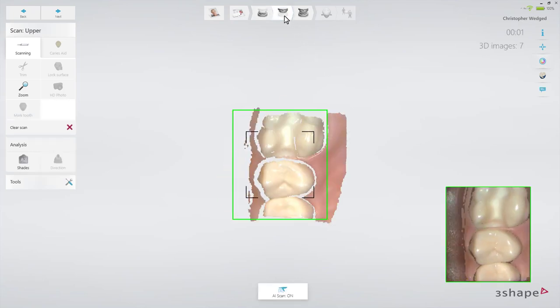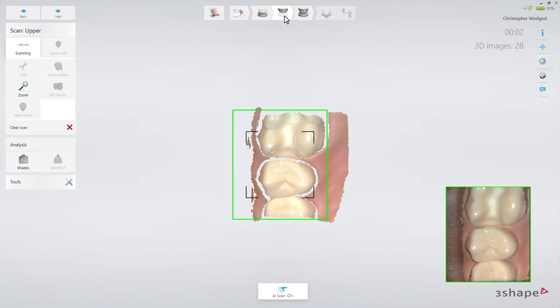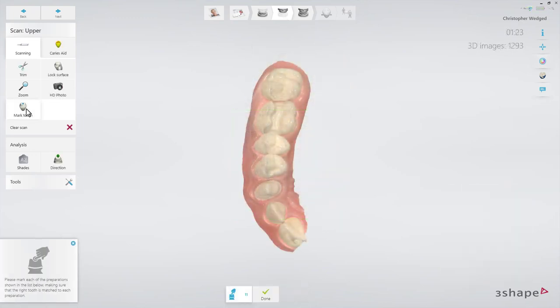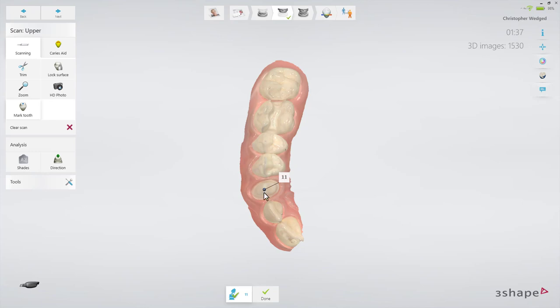Start scanning. When the scan is ready, mark the tooth chosen in the order form, and move to the analyze page.